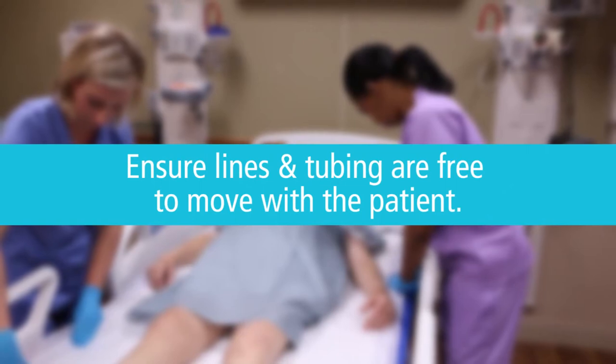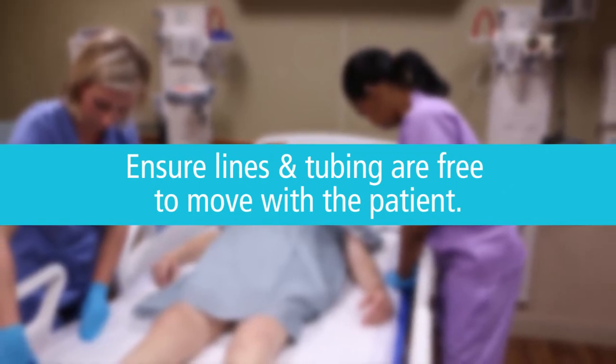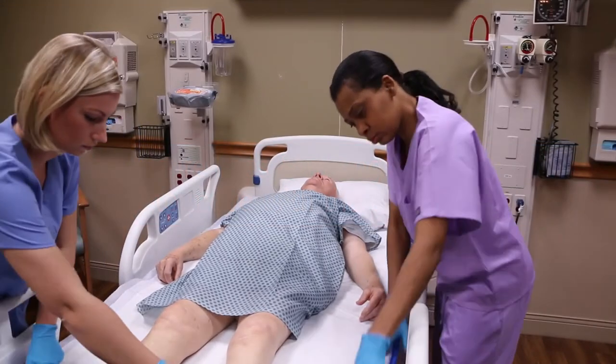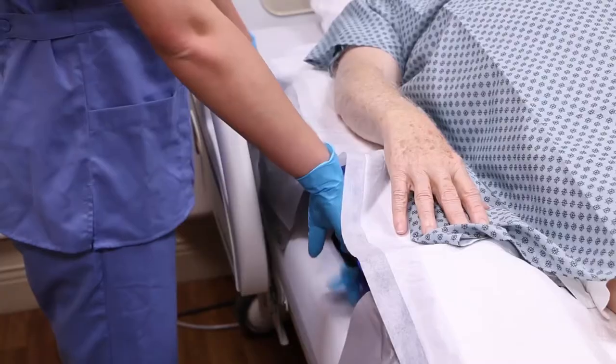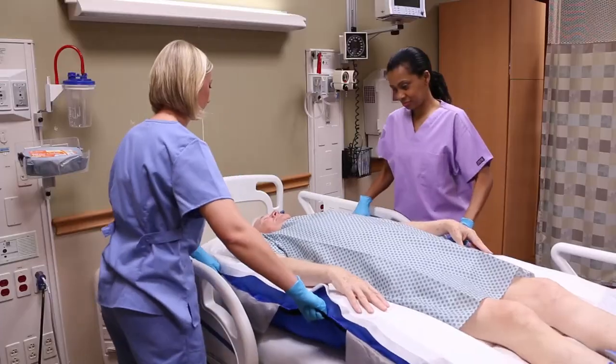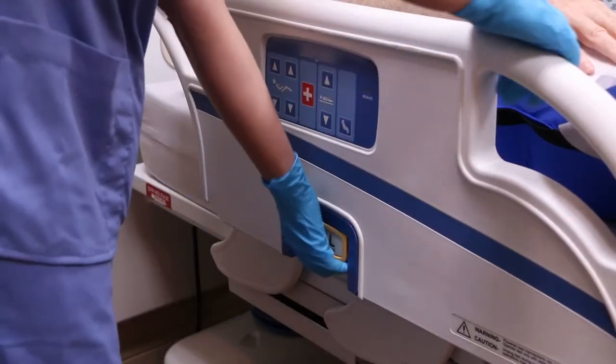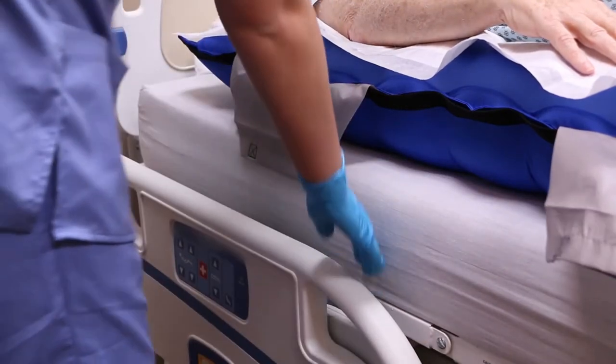Before repositioning the patient, check to make sure lines and tubing are free to move with the patient. Ensure that the patient's head and feet are supported. Using the black handles, line up the patient's hips with the hinge point of the bed.